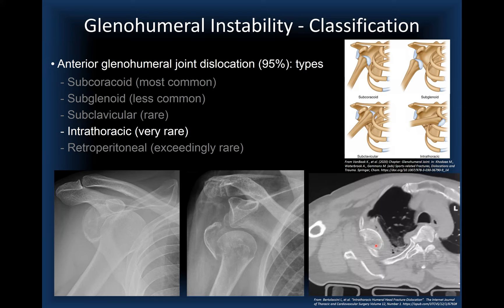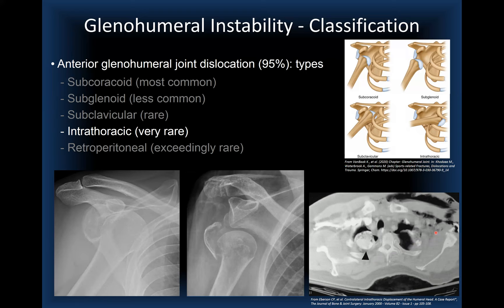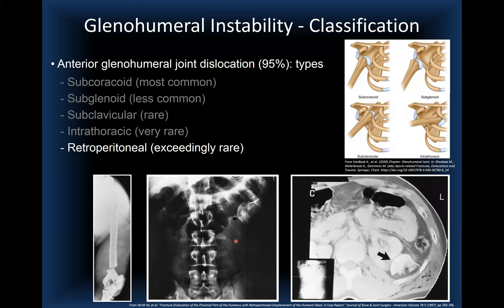Another extreme case from the literature shows a left proximal humerus dislocation with rib fractures, where the humeral head ended up as a rounded density in the contralateral right upper lung zone. CT demonstrates the path the humeral head traveled to reach the contralateral lung field. Remarkably, this patient survived. Another case shows the humeral head in the retroperitoneum adjacent to the left kidney.